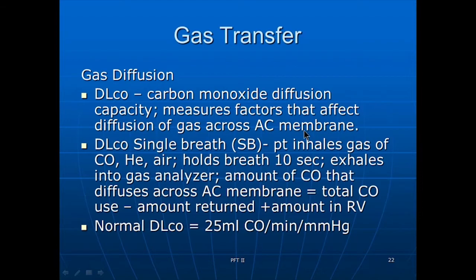So they have what they call a DLCO single breath. The patient inhales a gas of carbon monoxide, helium, air. They have this machine, and you don't really need to know these numbers, but they use 0.3% carbon monoxide, a very low amount.